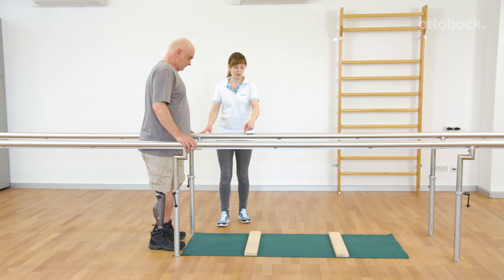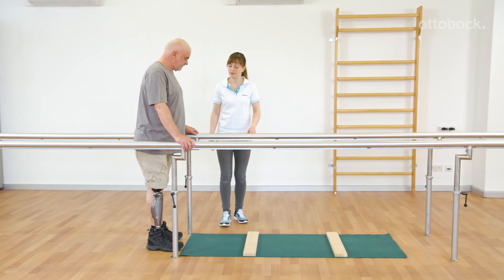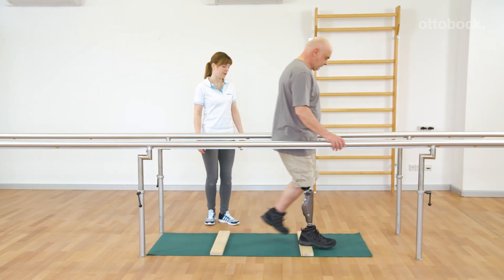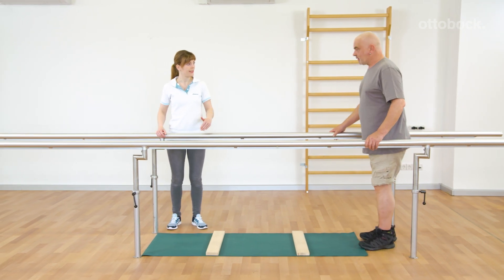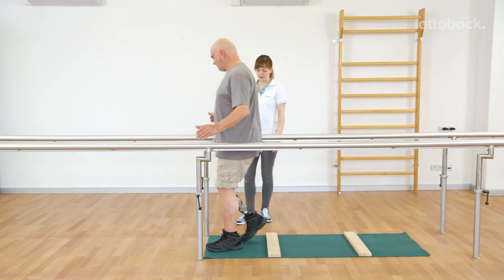This exercise is a good preparation for walking downhill using the yielding technique. Gerhard trains an even walking rhythm. Before walking down a slope, he can focus on the right technique and timing between the parallel bars.